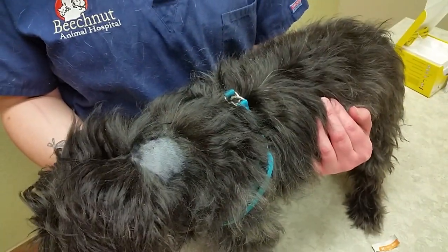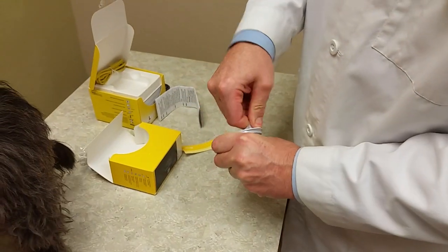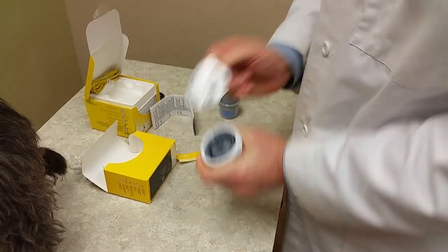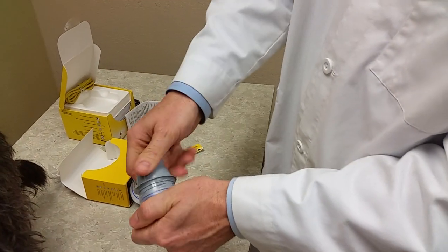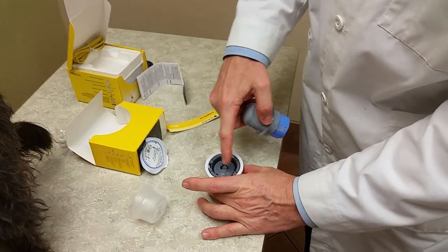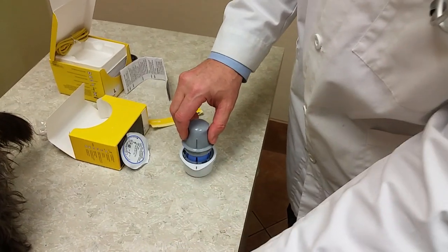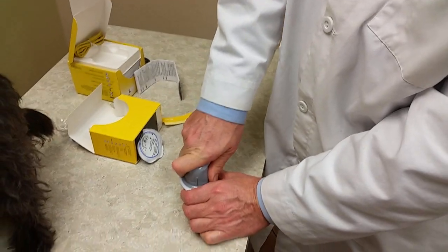While that's drying, I'm going to open the disc. Here's my applicator. I'm going to line up the slot with the front of the disc itself and just push all the way down. That'll grab the disc.